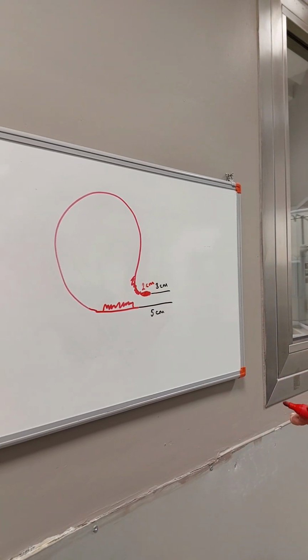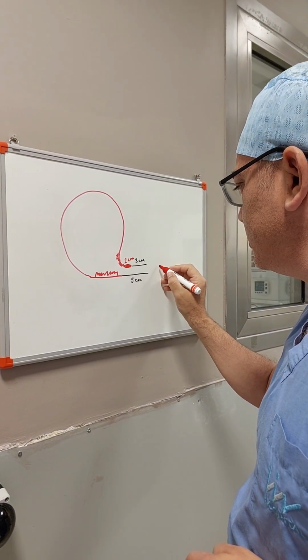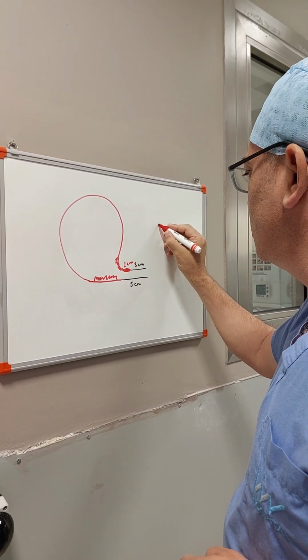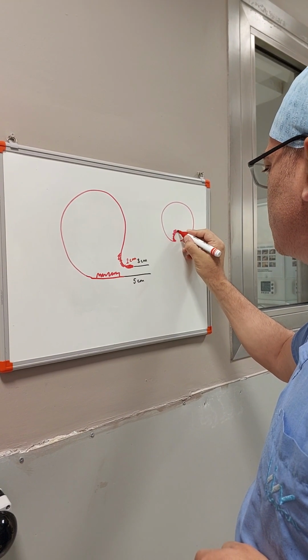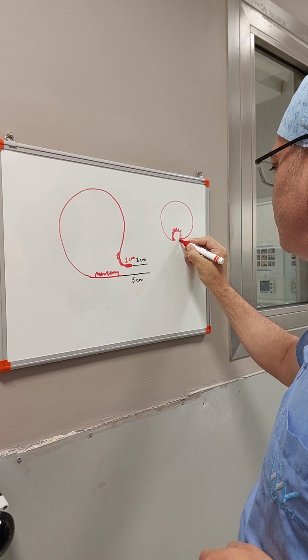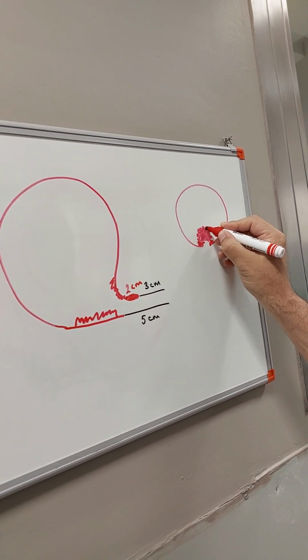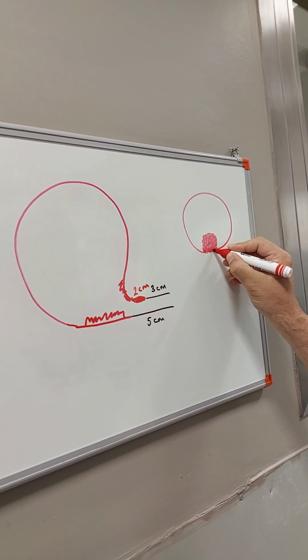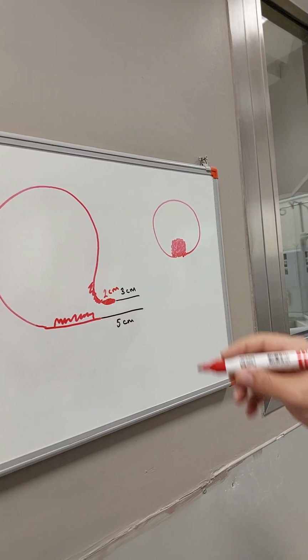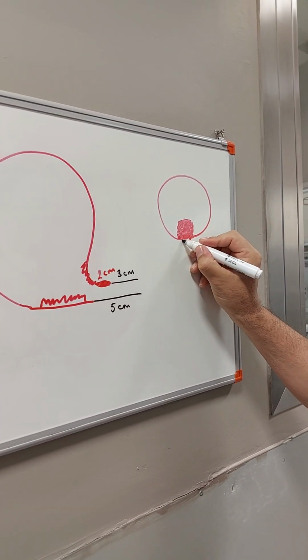So now we change our procedure. Now we go in with the flexible instrument first, and it shows us all the leukoplakia tissues in the trigone and in the bladder neck correctly, and they are just these very red, inflamed areas. Okay, we see the bladder like this, and the urethra is now here like this.